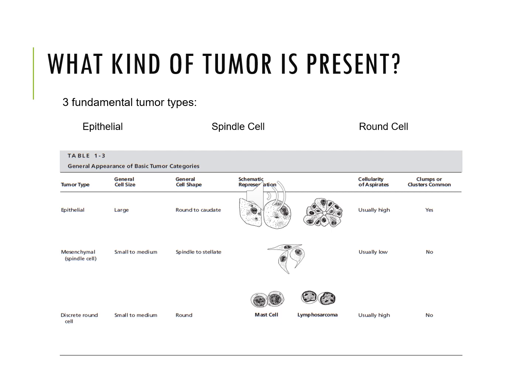When discussing mesenchymal cell or spindle cell tumors, these are usually small to medium-sized cells. They're spindles, so they have a round to oval nucleus, and then they come to a point at either end, and they can be found individually or in small aggregates as well. And these, like I said previously, do not exfoliate as well as epithelial cell or round cell tumors.